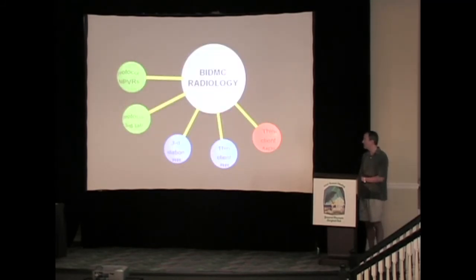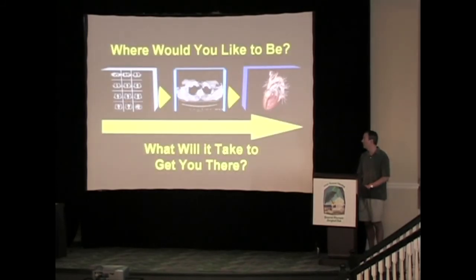So again, in my department, we have a protocol, lab and tech things, 3D workstations. We're getting involved in the thin client servers for radiologists and are working towards trying to get them out to our referring clinicians as well. So wherever you are right now, I hope that everyone will eventually reach a point where they're able to use these very freely for planning purposes, interacting with them, and also as a way of helping to communicate with your patients about their diseases and their planned surgeries.